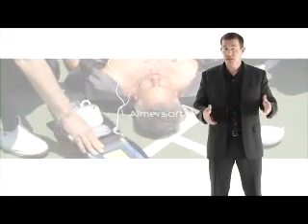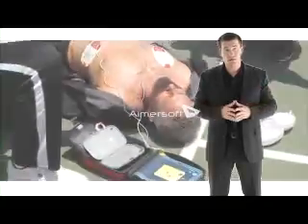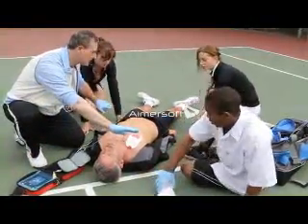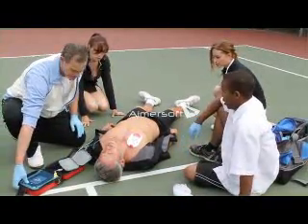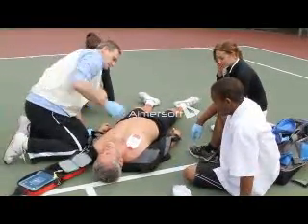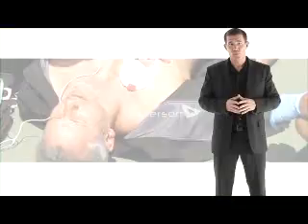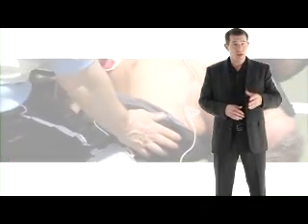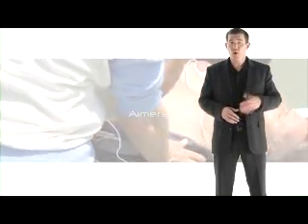Clear the victim. State loudly, "Clear." Check to see that no rescuers or bystanders are touching the victim or their clothes. Press the shock button if prompted. Some AEDs will shock automatically. Resume chest compressions immediately. Do not stop CPR unless the victim begins to move, the AED prompts you to stop CPR, or help arrives and is ready to take over.